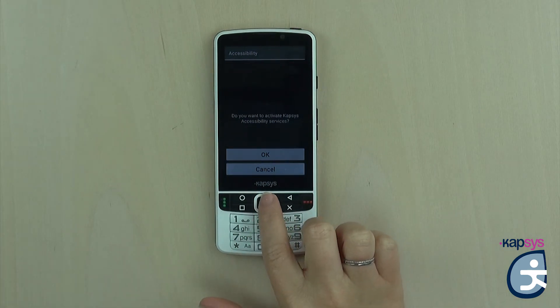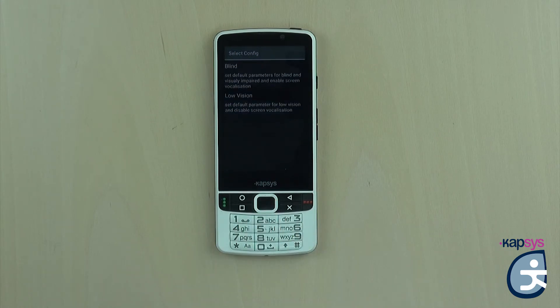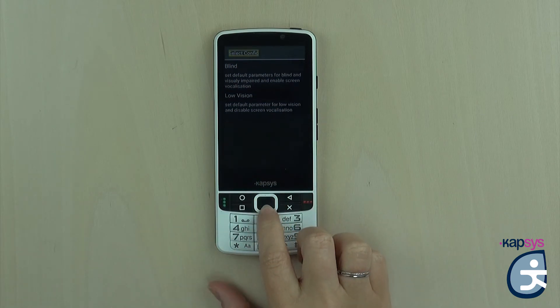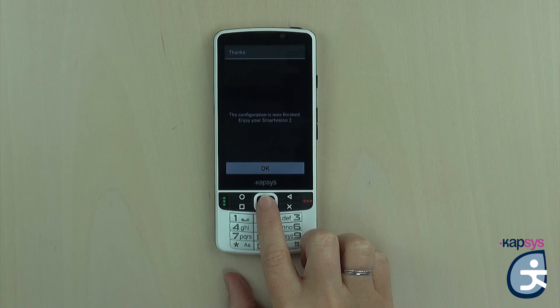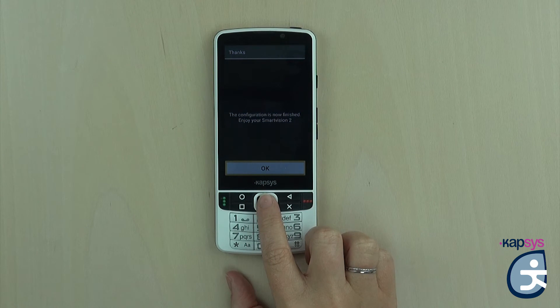The phone is now giving you the choice between a blind mode or a low vision mode. The main difference between these two modes is the voice synthesis. In low vision mode, you will not have a voice feedback of the selected item. For this tutorial, we will select blind mode to have voice synthesis all the time. I use the down arrow, select 'config blind — set default parameters for blind and visually impaired and enable screen vocalization,' and confirm with the OK button.